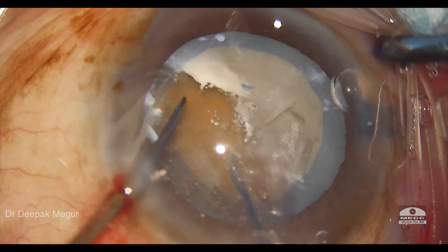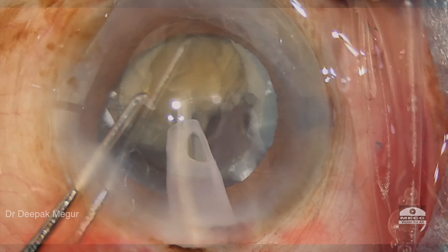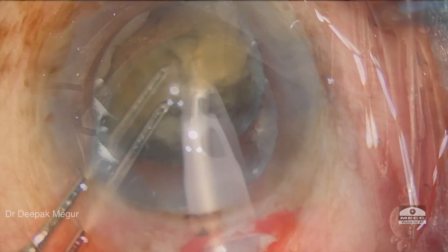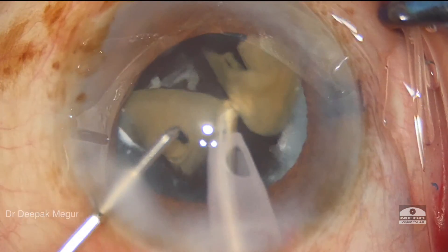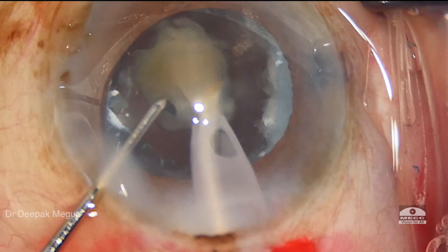We now have a capsulotomy of decent size and proceed with phacoemulsification. The nucleus is divided into multiple small fragments gently and then emulsified and aspirated. Care must be taken not to impart any zonular stress, remembering that we are dealing with a hypermature cataract in an elderly patient.